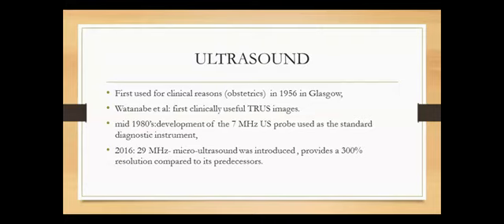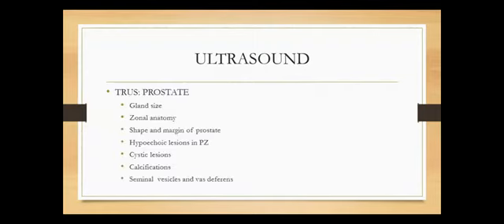In 2016, they introduced the 29 megahertz micro ultrasound, which has been a game changer so far as compared to its predecessor, the 7 megahertz. It provides about 300% resolution compared to its predecessors.